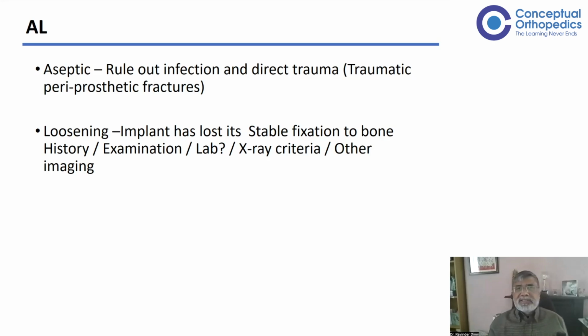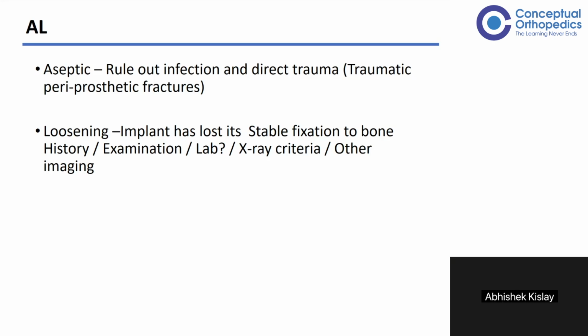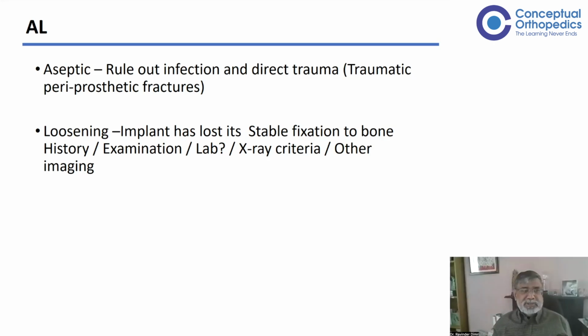in B3, it is a long term wear that leads to osteolysis, and osteolysis, because the bone quality is so bad, you're absolutely right, it could be that it has loosened first and then broken, but it is also possible that the patient had no symptom till it actually breaks. The confusion is whether you call it a periprosthetic fracture or osteolysis, but it doesn't matter. Treatment is the same. So there's a bit of overlap in diagnosis there.